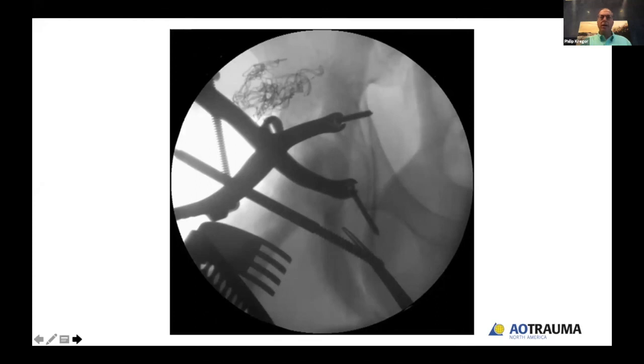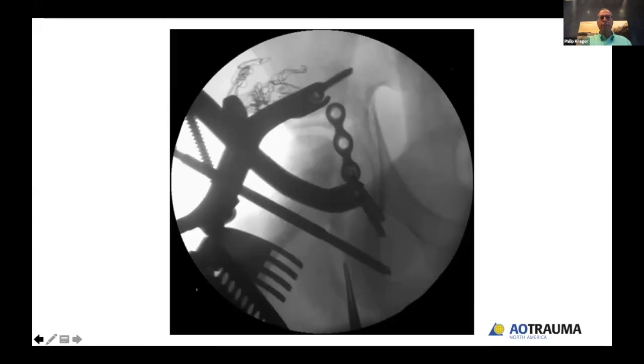Here's a mistake that you can make. That is utilizing a screw-to-screw clamp after the short angle jaw forceps is not successful, a screw-to-screw clamp, but please note, this is a mistake. There's a screw across the transverse fracture and you're not going to be able to reduce that. So then we can reorient that screw above the transverse fracture.